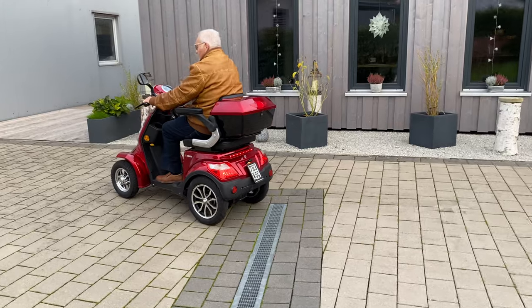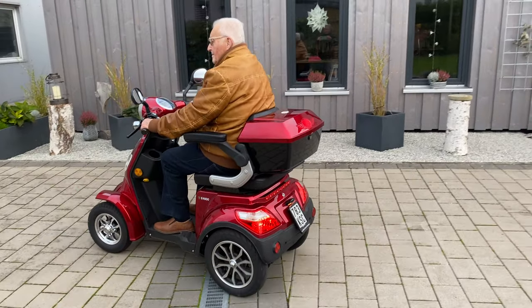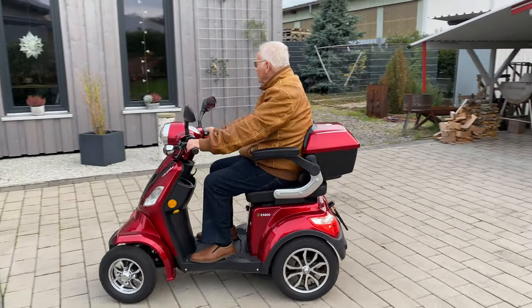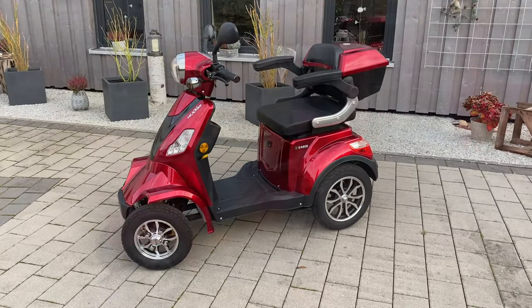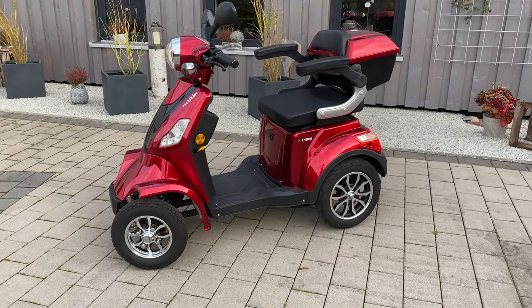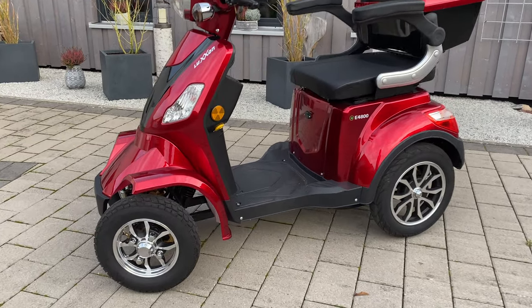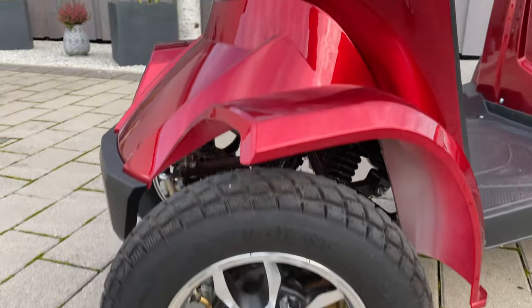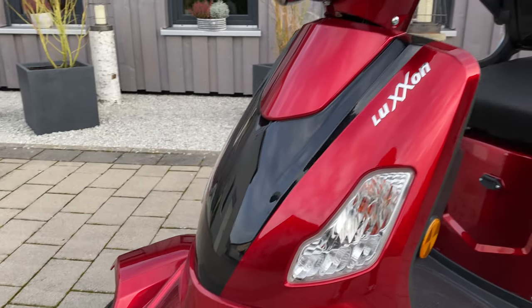An acoustical signal sounds when reversing. Now a few more technical details: the light alloy rims, the color, and the overall design make the look of the mobility scooter very modern.